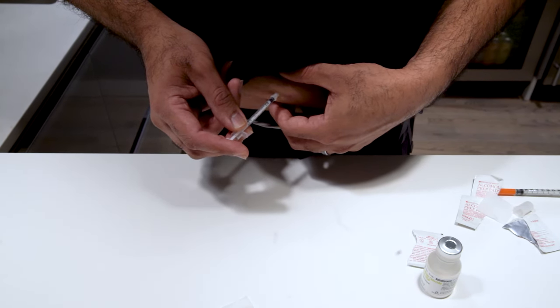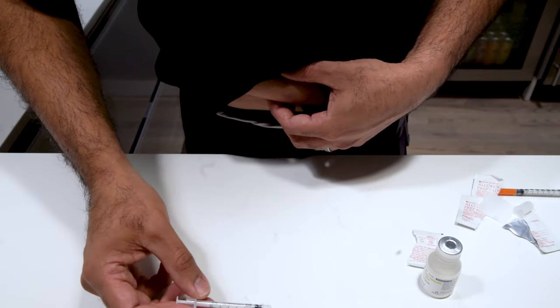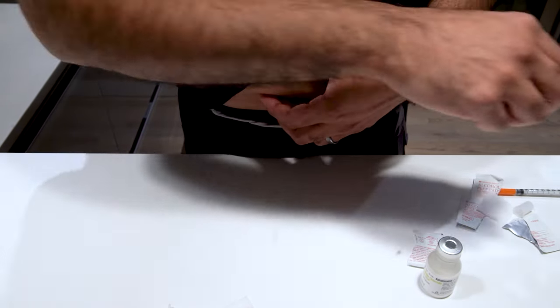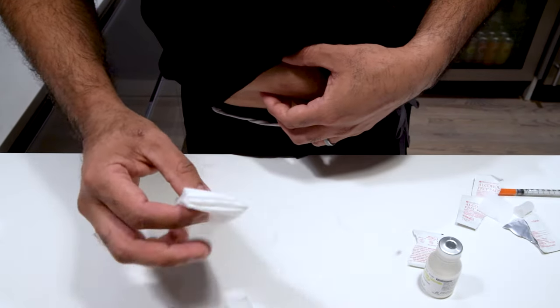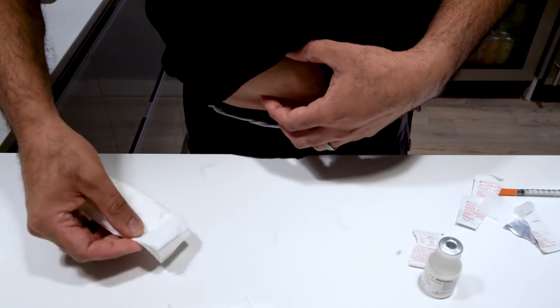I just want you to hold that syringe there once you're done injecting for about five seconds. Be careful not to pinch your skin here and push the fluid out. Once you're done in five seconds, pull the needle back out, rest on the table. Most of the time you won't see any bleeding, but if you do, this is where the kleenex comes in handy. Just wipe a little area off. It will not bleed continuously, such a small hole.